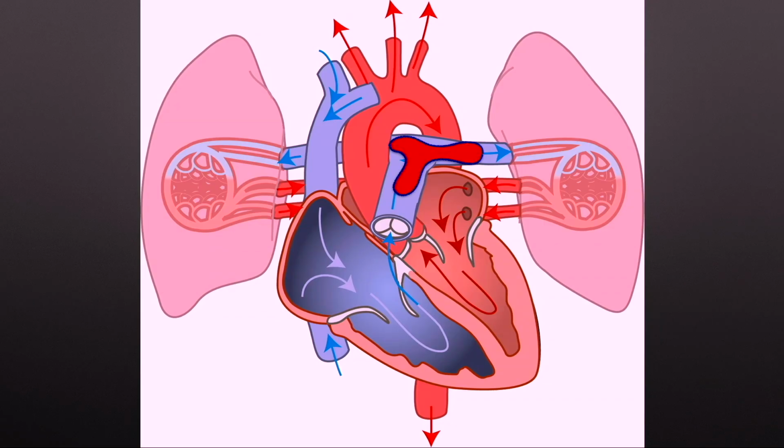If there was a big blood clot or something like that, and you're just not able to get blood past the lungs, past the alveoli themselves, then you may be building up CO2 in the body through here, but it just can't get past this giant blood clot. And so your PCO2 right here might theoretically be 60, 70, but all you're reading on your end tidal, because that's what's going past your lungs, is 10, 20, 30, maybe totally normal.